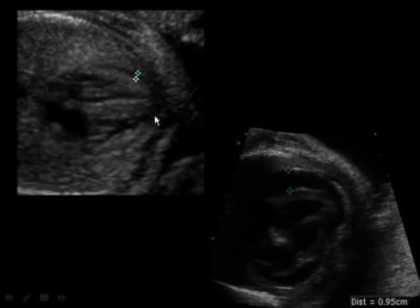Well, here's the possible pericardial effusion seen here. But this is actually just the edge of the myocardium. You can see some echogenic inner edge and then the hypoechoic myocardium here. When in doubt, try to identify whether this possible fluid goes past the level of the valves. If it crosses the level of the valves, it's much more likely to be fluid, as seen in this patient, where you see the myocardium here and the pericardial fluid going all the way around the level of the mitral valve.